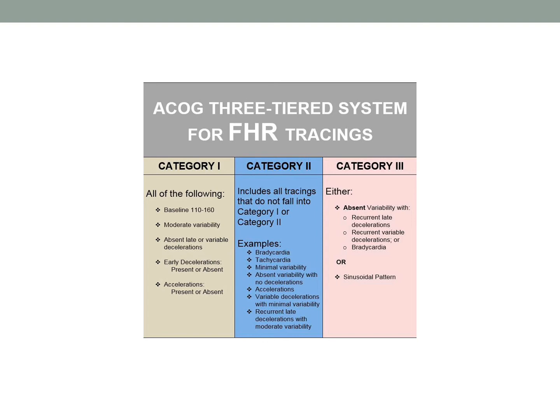So category 1 is what we strive for. This is what we want, okay? Category 1 fetal heart tracings are normal. This is what we want. It's what's expected. They are strongly predictive of normal fetal acid-base balance. They may be followed in a routine manner and no action is required. So if your fetal strip is a category 1, you as a nurse, you document and you hope that it continues to be a category 1.